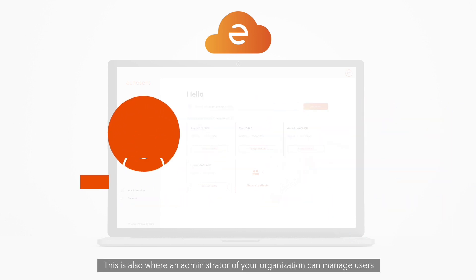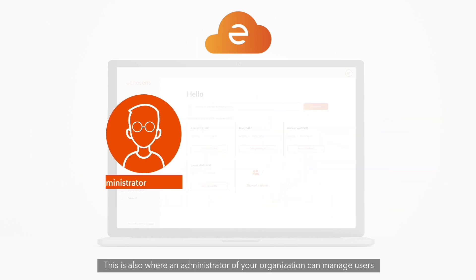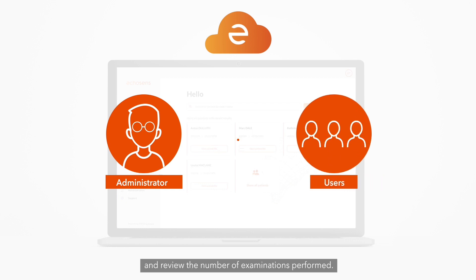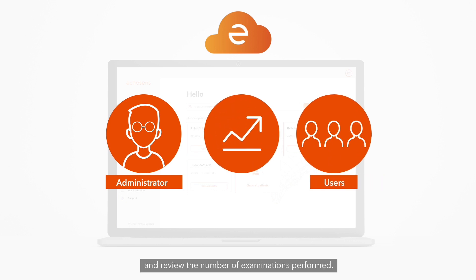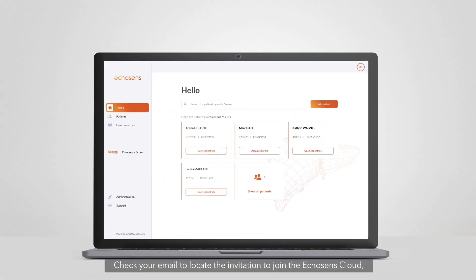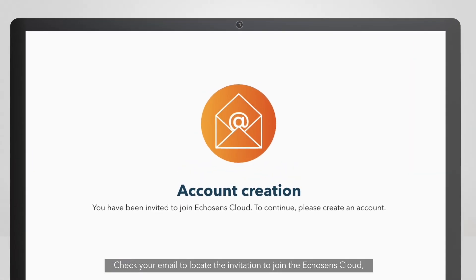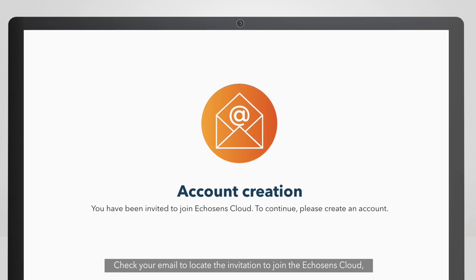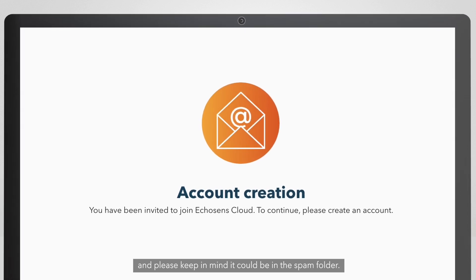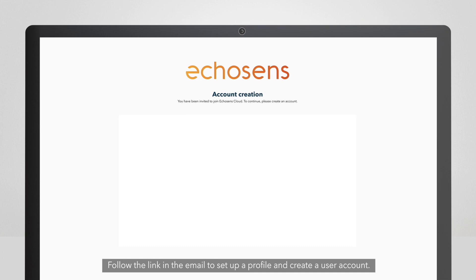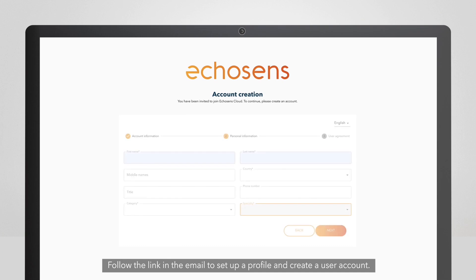This is also where an administrator of your organization can manage users and review the number of examinations performed. Check your email to locate the invitation to join the Echosense cloud — please keep in mind it could be in the spam folder. Follow the link in the email to set up a profile and create a user account.